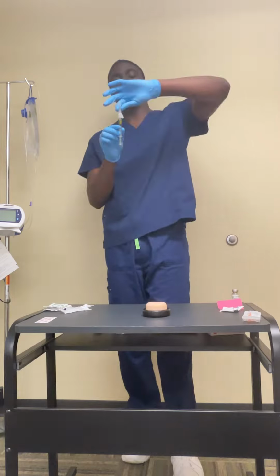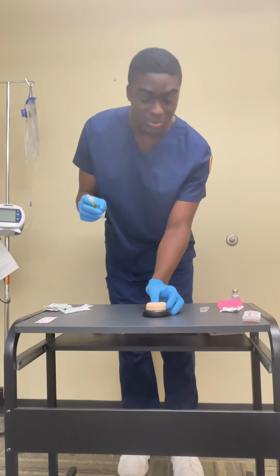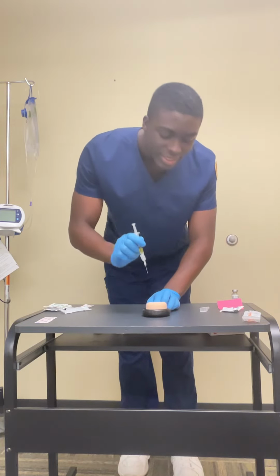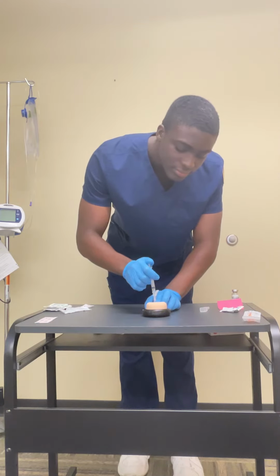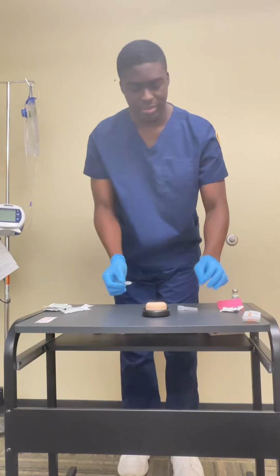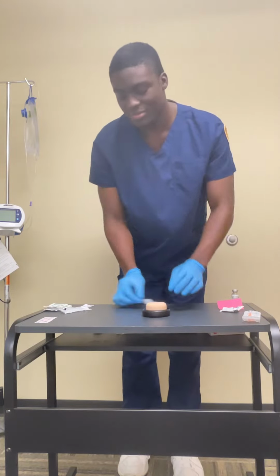Uncap my needle, and since I'll be using the Z-Track method, I will pull the skin 1 to 1.5 inch down, and then go in at 90 degrees. Inject the vitamin K, then return the skin fold over. Recap my needle for recycling purposes, but I would engage the safety and then put in the sharps.